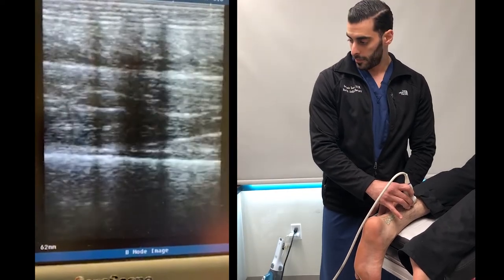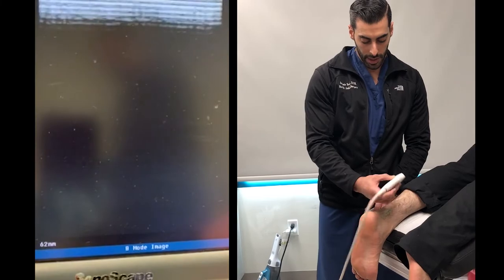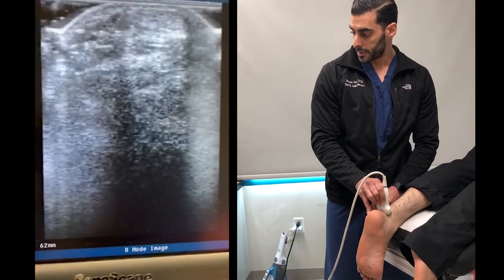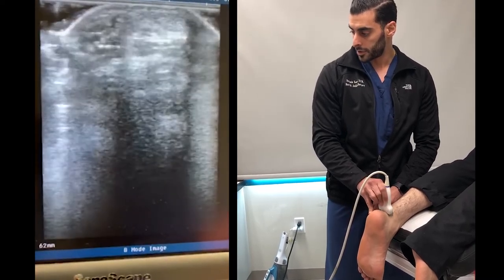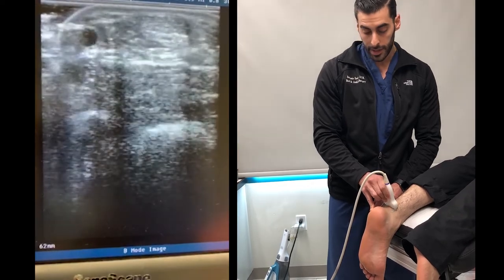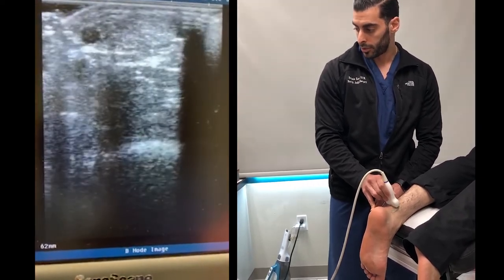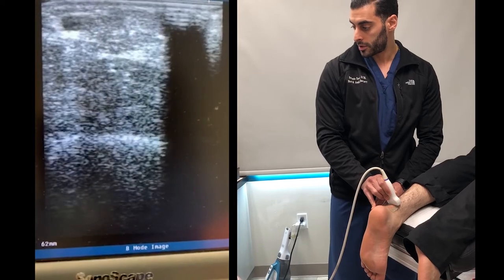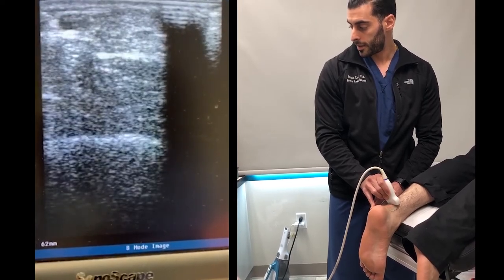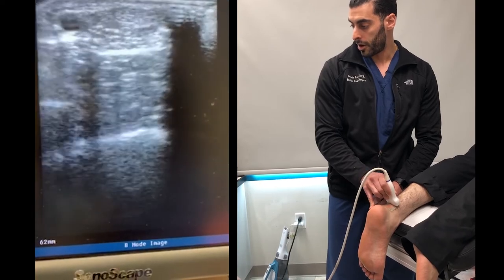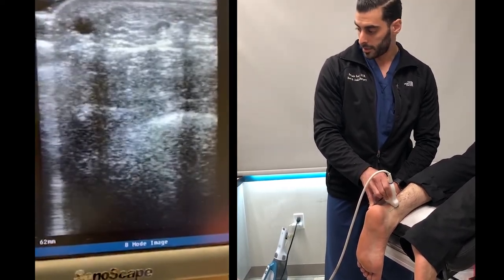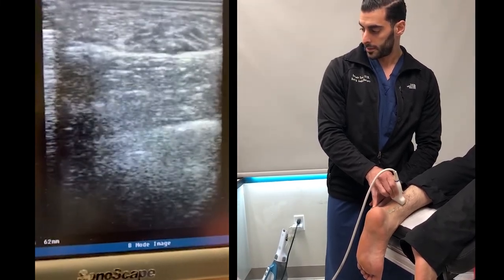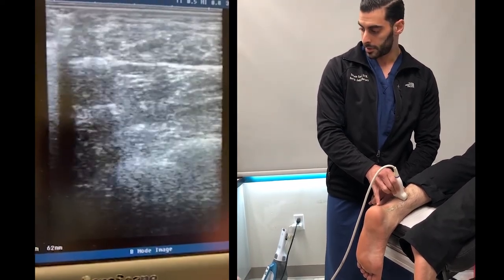For instance, if my transducer is not fully applied — moving to the axial view — you can see the tendon in the axial, starting from the insertion and working up. If I take my probe off on the medial side, you can see that hypoechoic image there, which may give you a false mimicking of tendinopathy. However, if I just place the probe on all the way, then you can see the full thickness of the tendon. In this patient, it appears to be normal.